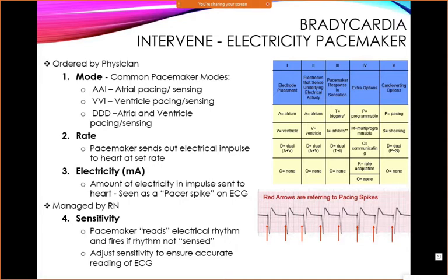And when it's in that dual mode, it triggers and inhibits. That is because trigger is only supposed to happen when a ventricle doesn't do something after the atrium. And like I said, it gets very confusing. There's no such thing as AAT. It just doesn't exist. It is AAI. All pacemakers are I. The T is a special situation, so don't even worry about it.